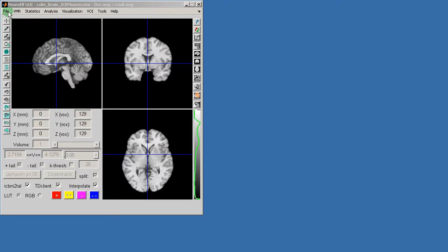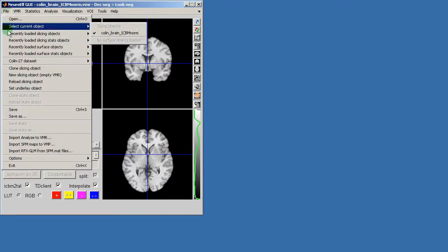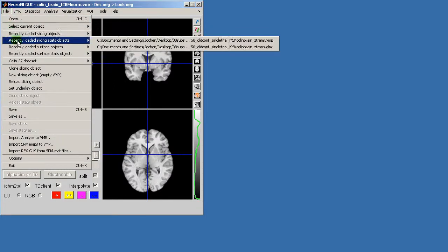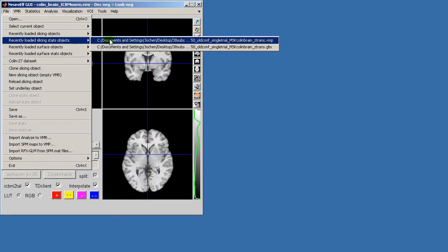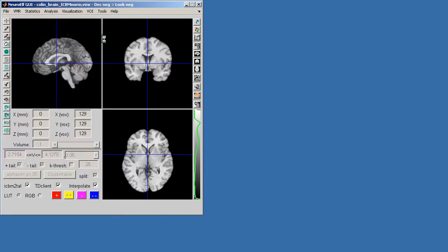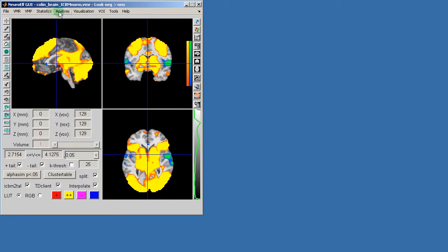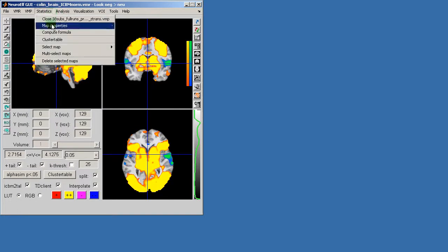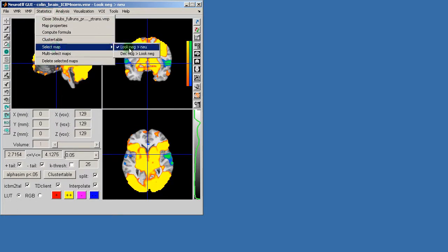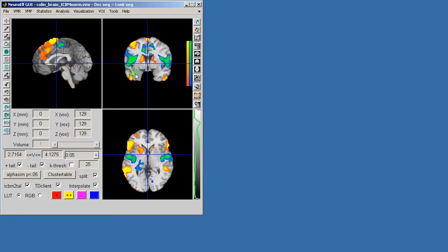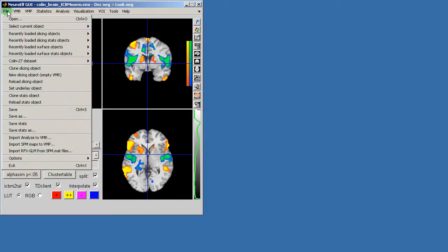First of all I'm loading a statistical object. In this case I'm simply selecting a map and then select the map that I want to show, which is the contrast, and the first option is to simply load a surface file.